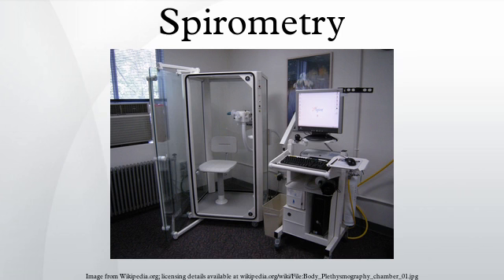Limitations of test: the maneuver is highly dependent on patient cooperation and effort, and is normally repeated at least 3 times to ensure reproducibility. Since results are dependent on patient cooperation, FVC can only be underestimated, never overestimated. Due to the patient cooperation required, spirometry can only be used on children old enough to comprehend and follow the instructions given, and only on patients who are able to understand and follow instructions.